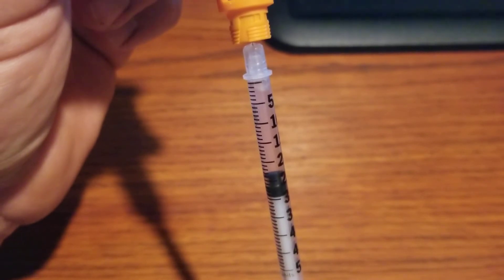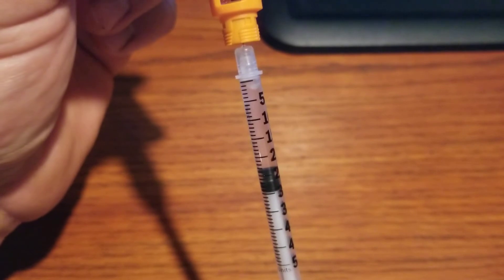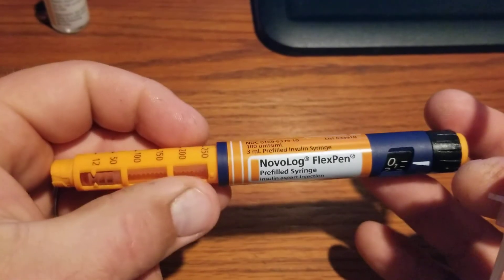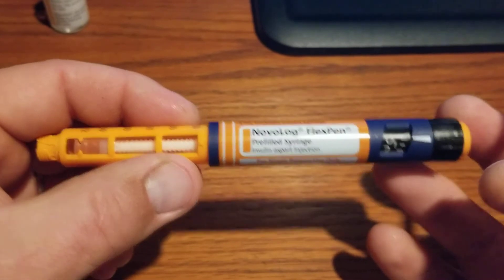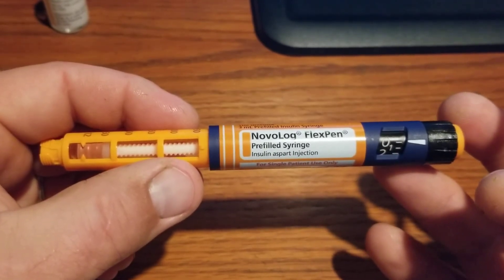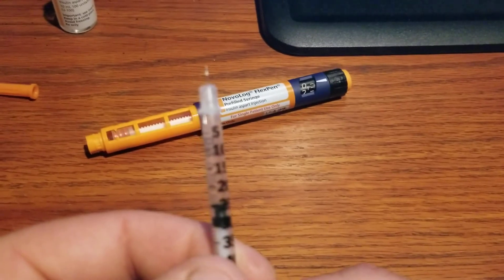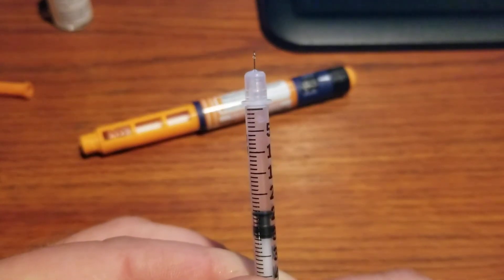This insulin is like gold. It's gotten a little cheaper in recent months, but this pen holds three milliliters of insulin — worth about $100 to $125 full. So this extra insulin I'm recovering, normally about 18 units, is meaningful.